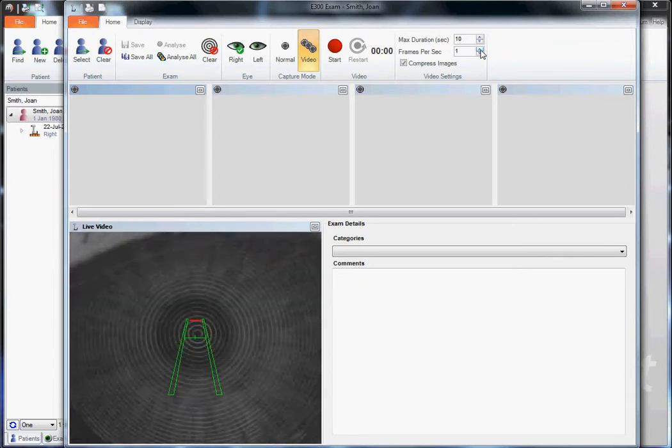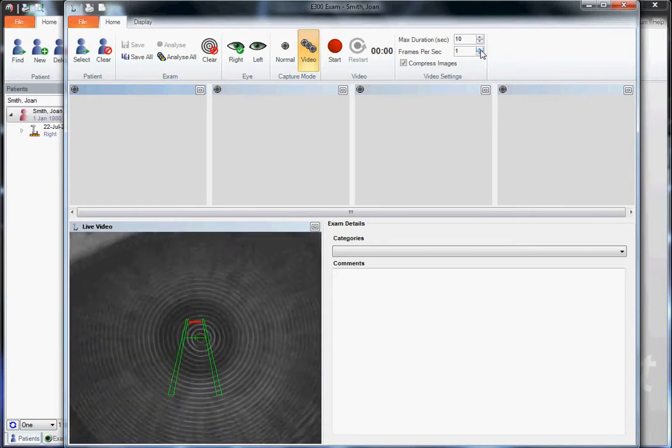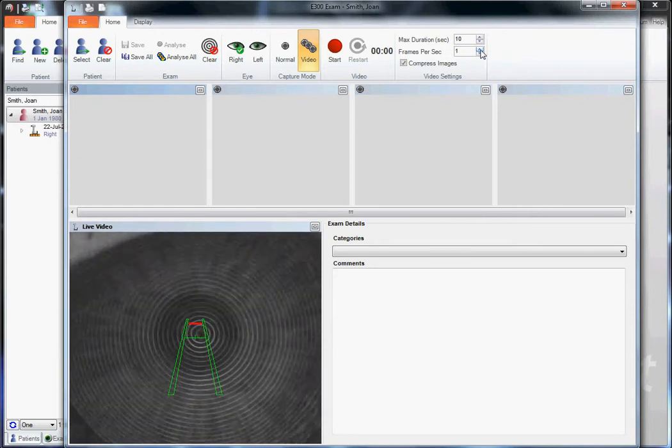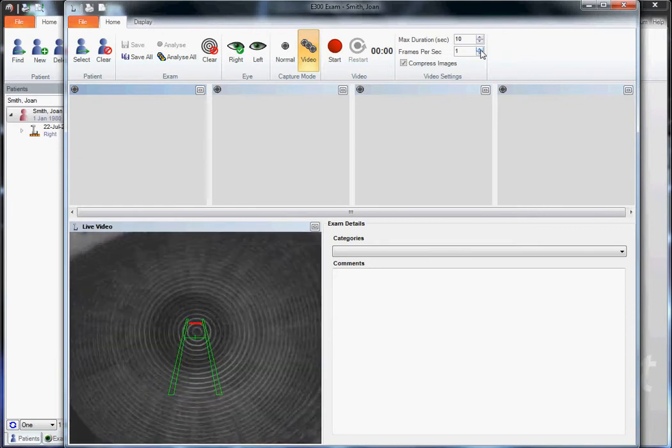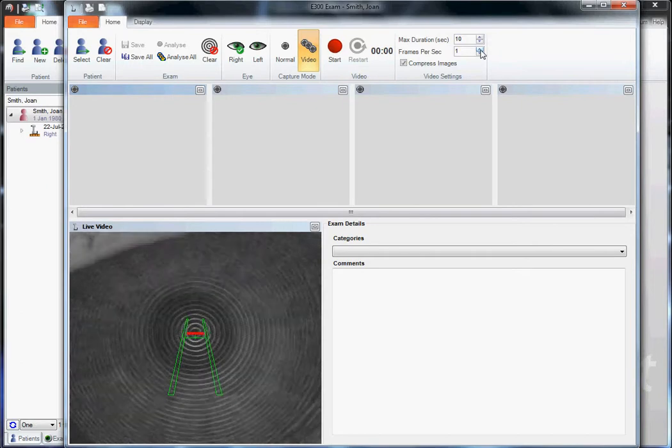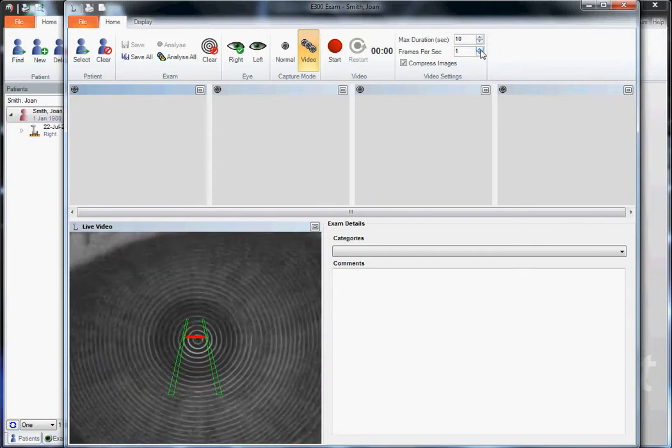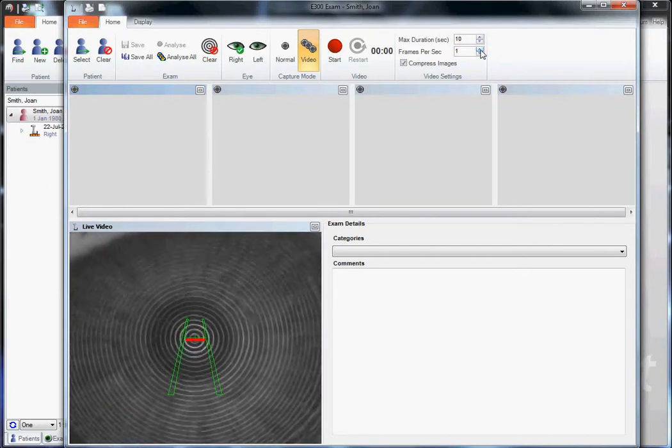Then we'll put the green crosshair on the central ring, then move our instrument closer so the red line lines up on the green.